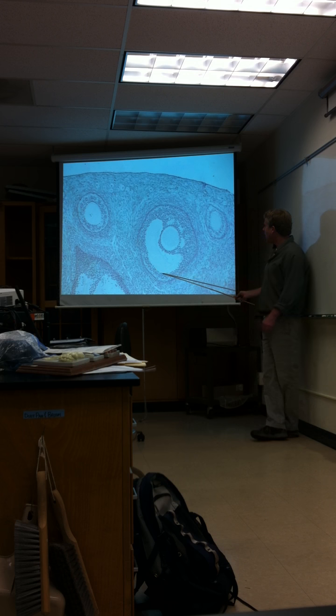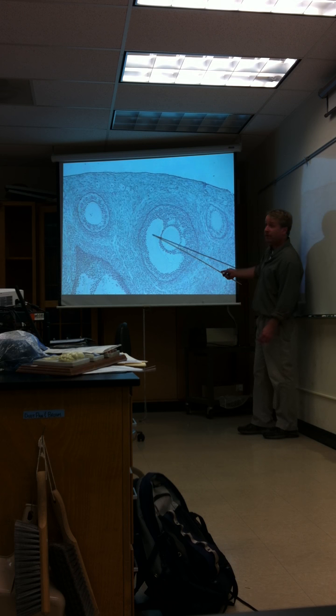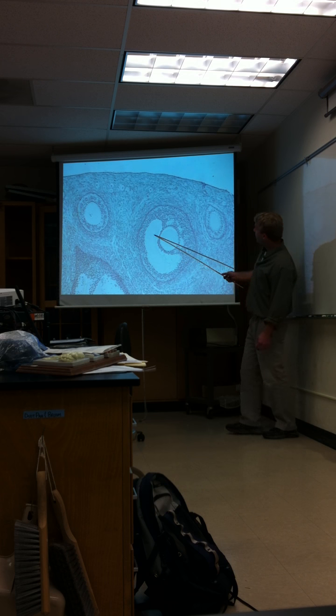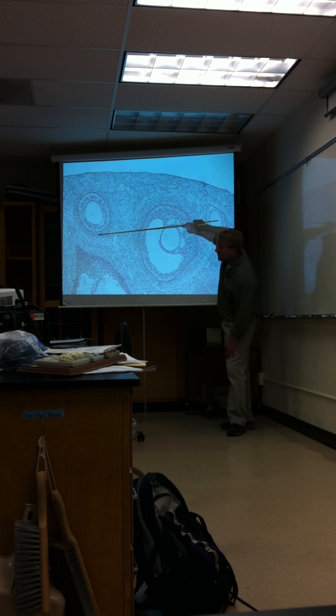I go over here, all of these cells also are granulosa cells. And so you can see or imagine these granulosa cells have secreted out all of this follicular fluid to create that antrum. One other thing you can see here, on this one, notice here are the granulosa cells. Just outside the granulosa cells, there's a layer right here. So this layer is the theca folliculi.